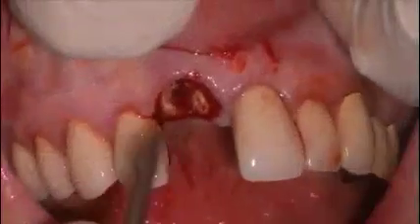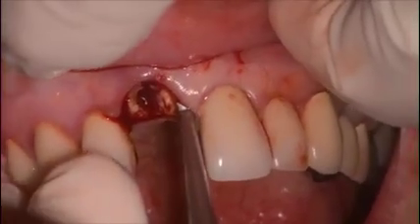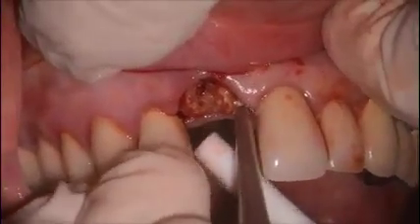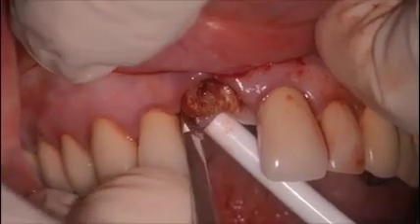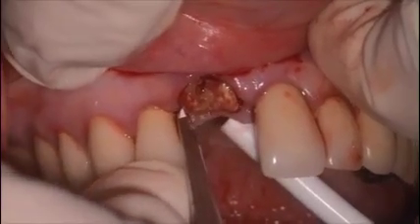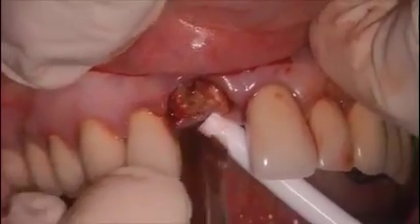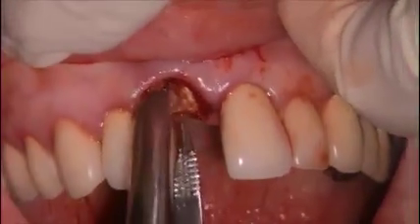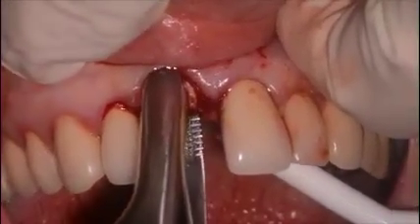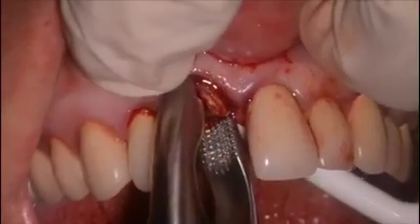These approximators are made by Carl Schumacher — I used a straight one. They look like an instrument that will create some leverage. I'm just gently moving the roots, mesial and distal, gently trying to create some movement. Afterward we can take a serrated forcep that will allow us to grab a hold of the root. Using a little soft tissue around the cuff of the tooth allows you, with root tip forceps — you can see the serrated forcep — to get a hold of the root, and with twisting and rotation we're able to remove this root gently in an atraumatic fashion.